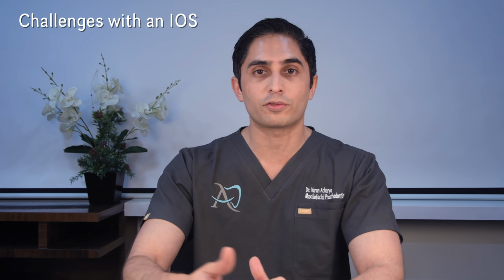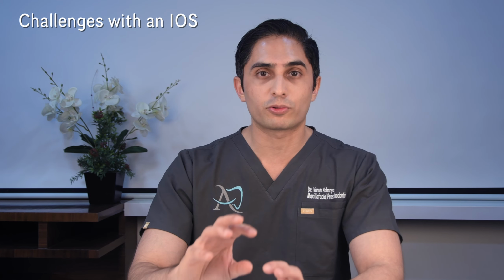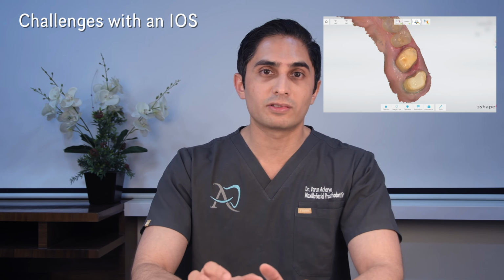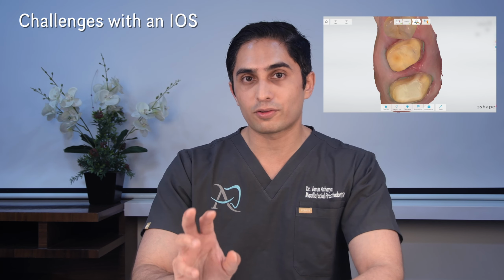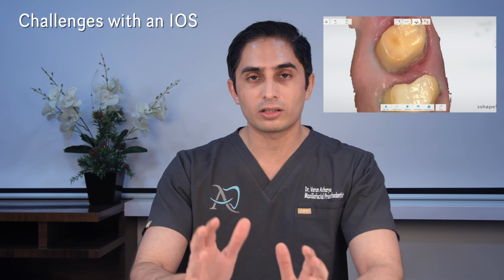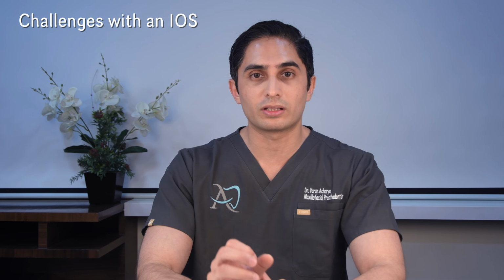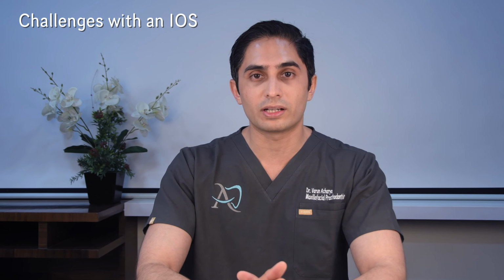So I see it on the software side in the lab, in various software, whether it's the 3Shape software or the exocad software or whatever it is. We see that the resolution of those very deep subgingival margins is not as great as we would like it to be. It is difficult for the lab tech. Heck, it's difficult for even me to identify those very deep subgingival margins, because we look at it on the computer, it's blown up, it's nice and zoomed in, but it's not so crisp. It's not sharp enough. There's not enough resolution when we go down to the depth.